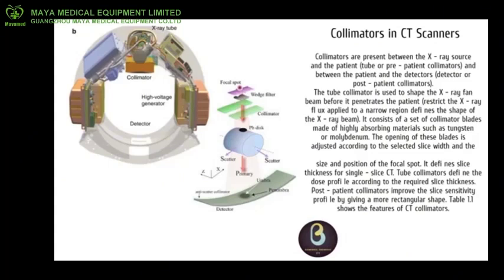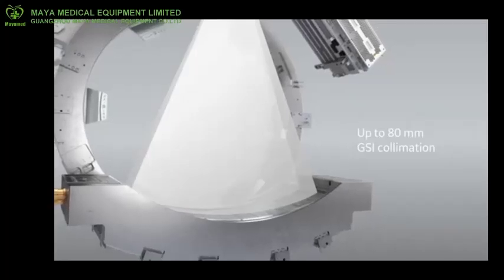The source collimation resembles small shutters with an opening that adjusts, dependent on the operator's selection of slice thickness. In MDCT systems, slice thickness is also influenced by the detector element configuration. Scanners vary in the choices of slice thickness available. Choices range from 0.5 to 10 millimeters.